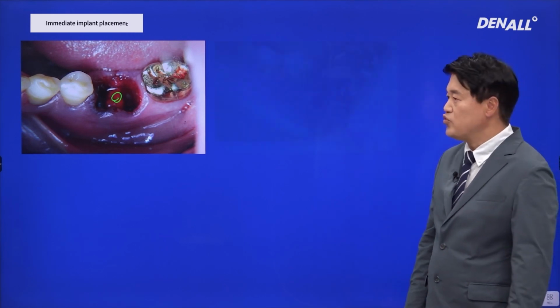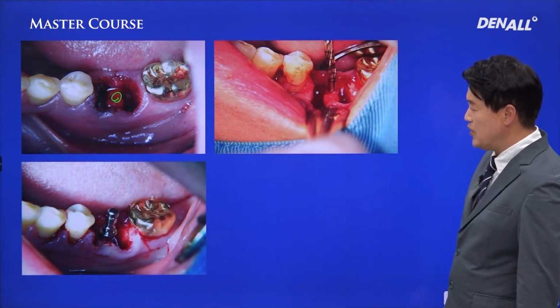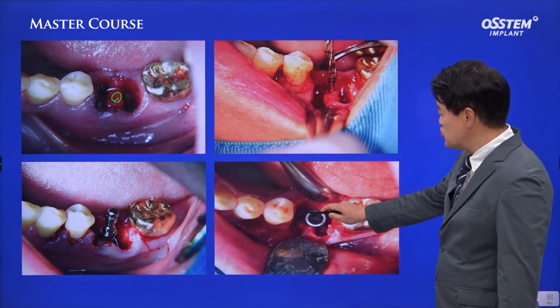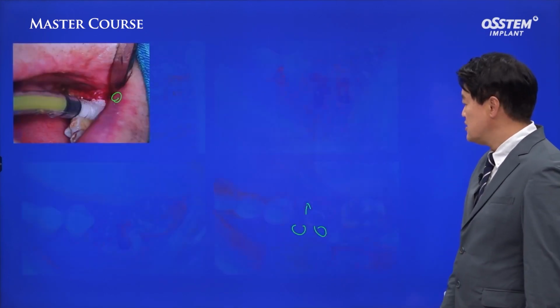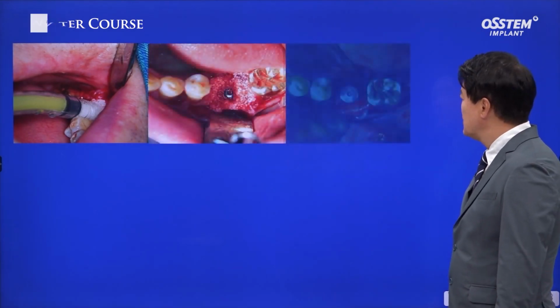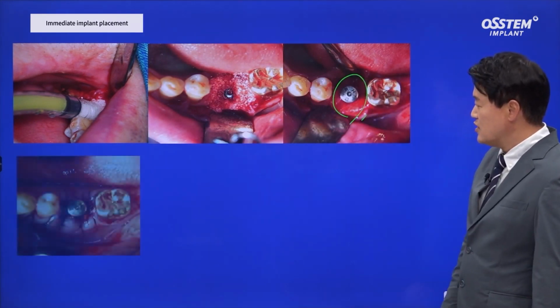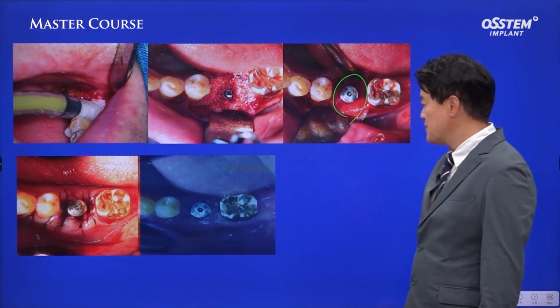This is going to be the center of implanted prosthesis, so therefore, I tried to place the implant here. I positioned it and I checked the position and evaluated using parallel pin. Implant was placed. It was slightly placed lingually and gap was formed on the buccal side. GBR was done. In order to manage soft tissue gap, a resorbable membrane was used and healing abutment was connected. Non-submerged GBR was done. This is after healing and prosthesis was delivered.